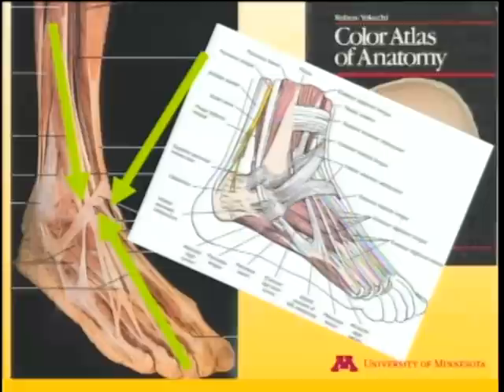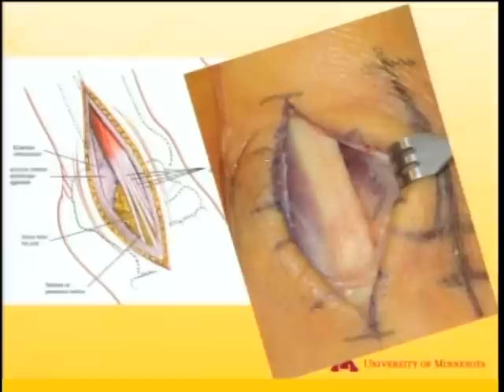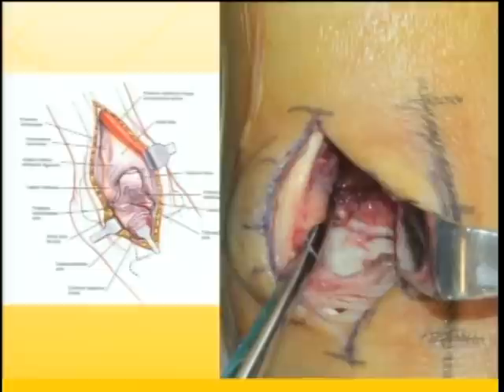So we just had a wonderful talk on the windows of surgery. And like Sean, I would say that you have to be prepared to work circumferentially around the ankle, and you need to know your intervals. So the anterolateral approach, which was nicely described, I'm simply going to do through a smaller window. This was a case I did last week. You can see the retinacular tissue and the distal part of the extensor digitorum, and that brings you right onto the anterior plafond, where you get excellent visualization, where you can book open the fracture and see the money.